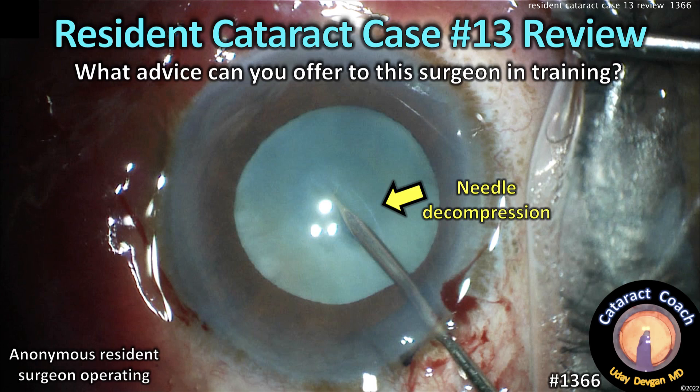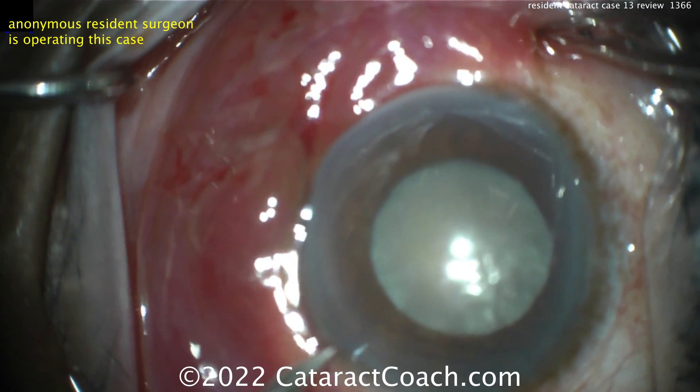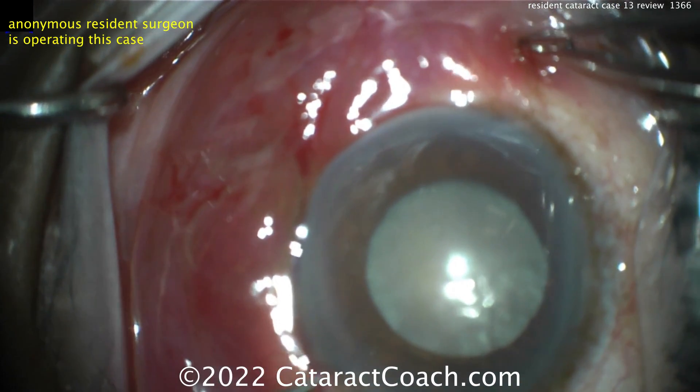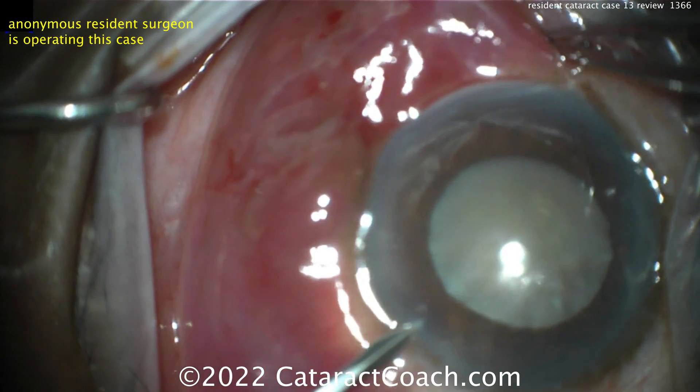CataractCoach.com, resident cataract case number 13 review. What advice can you offer this young surgeon in training? This is not my resident and I'm not the attending, but it's a nice video and I think we can all learn from it. Case number 13 — this is a pretty tough case for case 13.